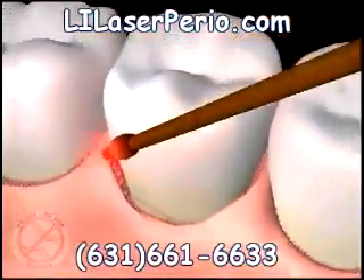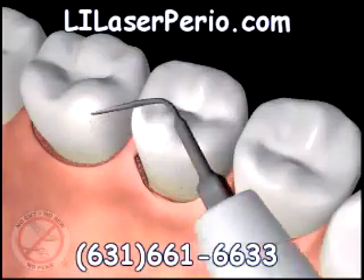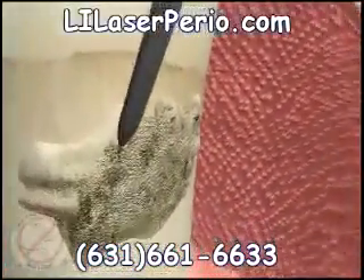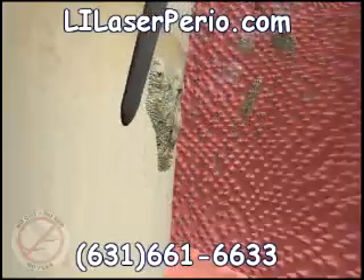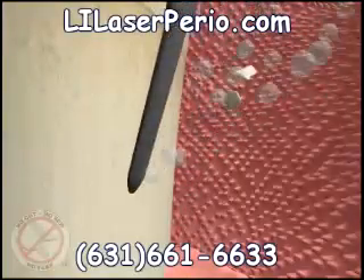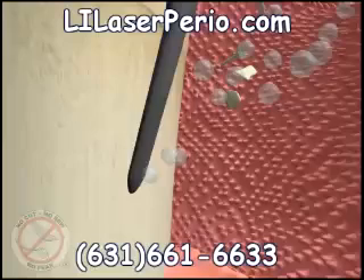The laser tip is then removed from the pocket and set aside. In the next step of the procedure, ultrasonic cleaners as small as the laser fiber tip are used to remove the hard deposits we call tartar or calculus from the top of the teeth and roots. These instruments use sound waves to vibrate and break apart the hard mineral calcium deposits, with water flushing away the debris and cooling the instrument tip. Some hand-cleaning instruments may be used at this time to remove any remaining hard calcium deposits.